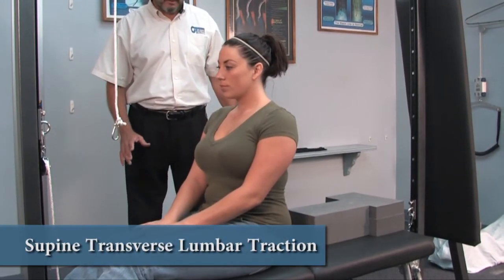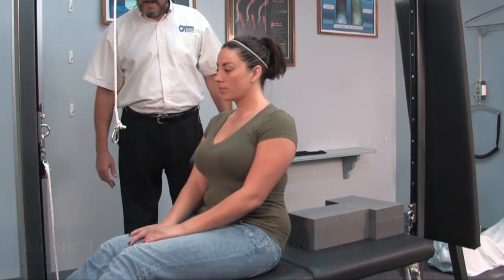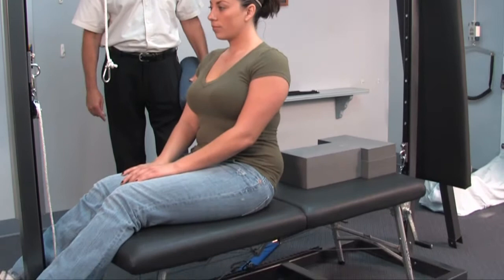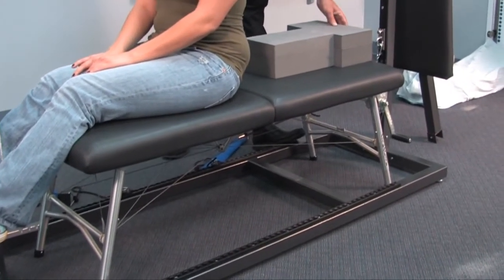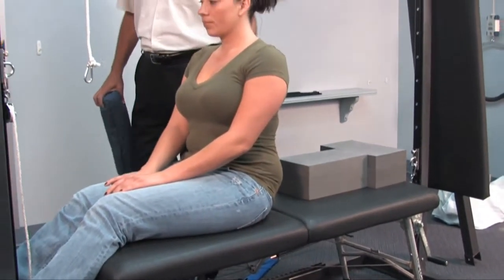Now I'm going to show you an example of a supine traction setup. We've placed the AstroGlide portable table, which fits very nicely inside of the standing unit, and we're going to utilize this for our setup. We're also going to utilize the traction blocks — there's a 3-inch, a 2-inch, and a 5-inch block.